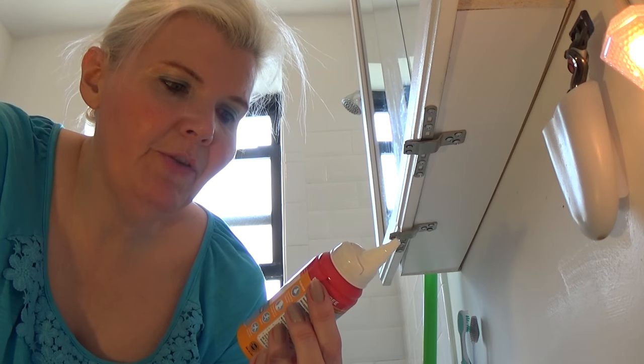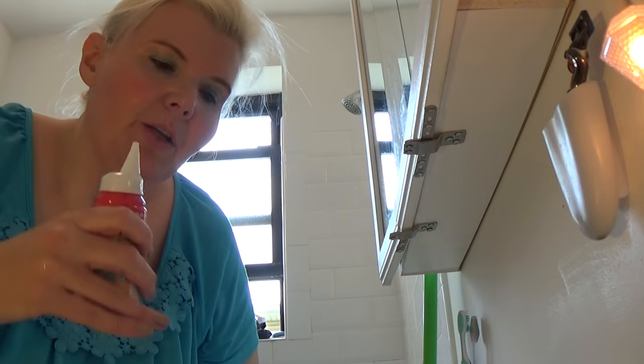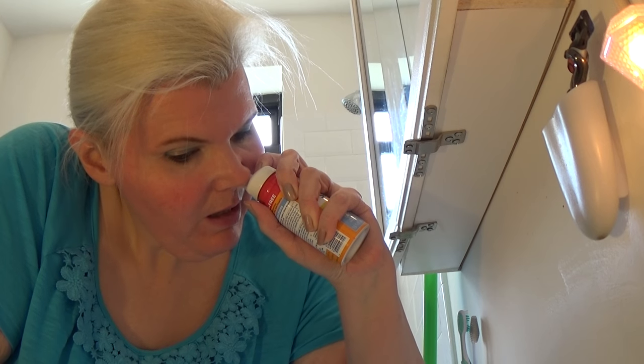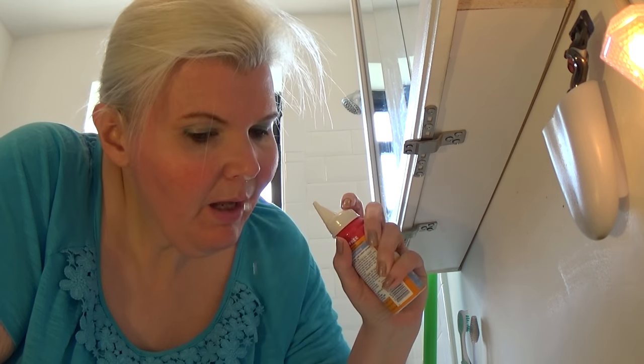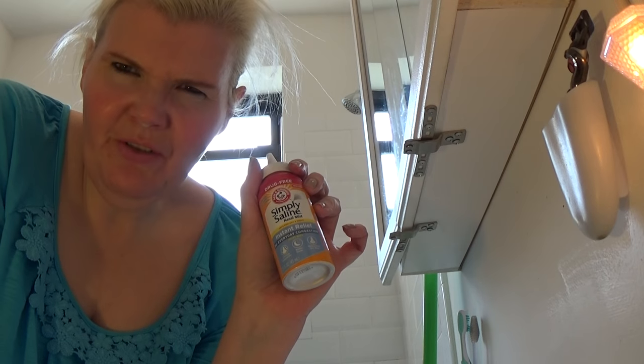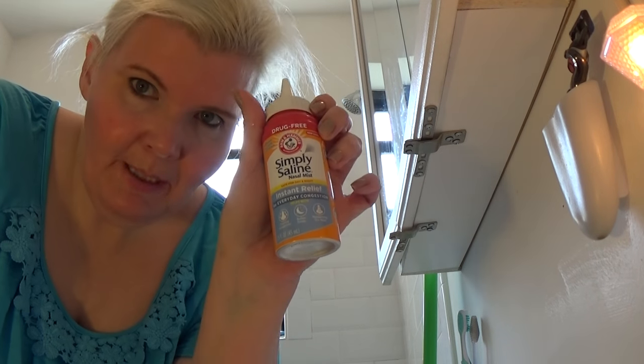It's Arm & Hammer Simply Saline Nasal Mist. You just put it in your nose, tilt over the sink just in case it leaks out, and that cleans out your sinuses. You do the other side — the brand should show on it. It really works; it flushes out your sinuses and removes all the allergens that are in there. I definitely recommend it.